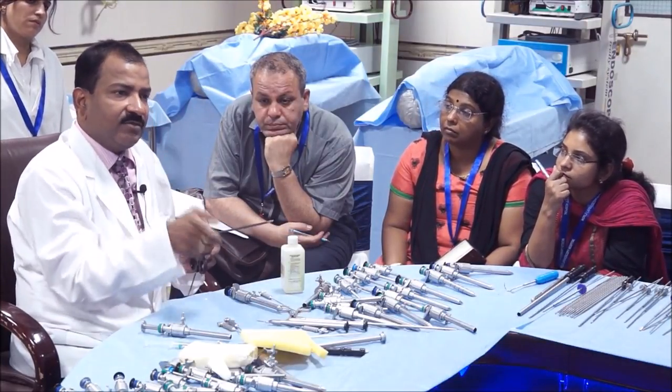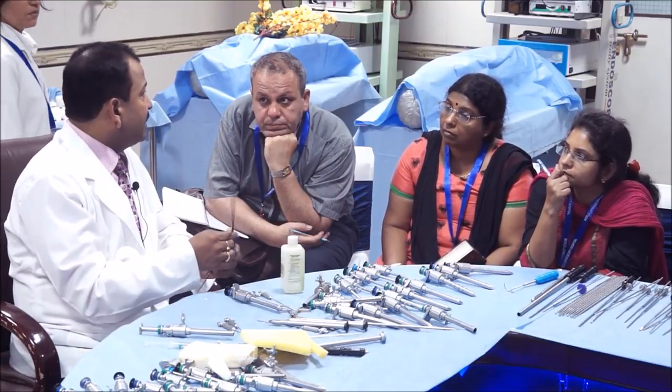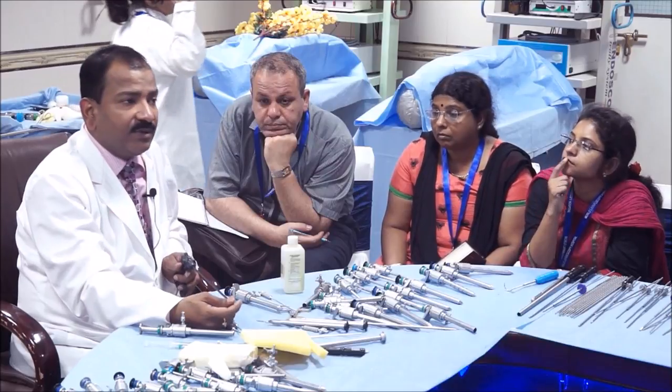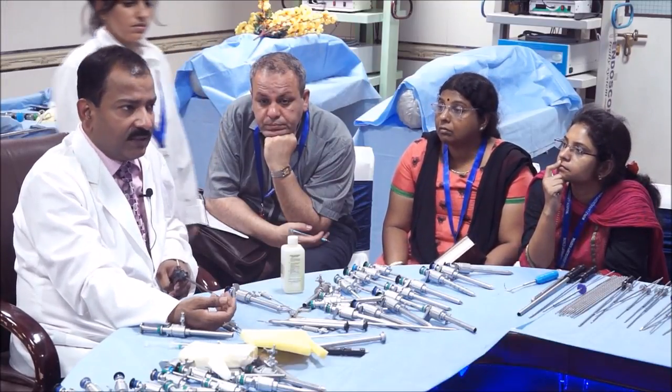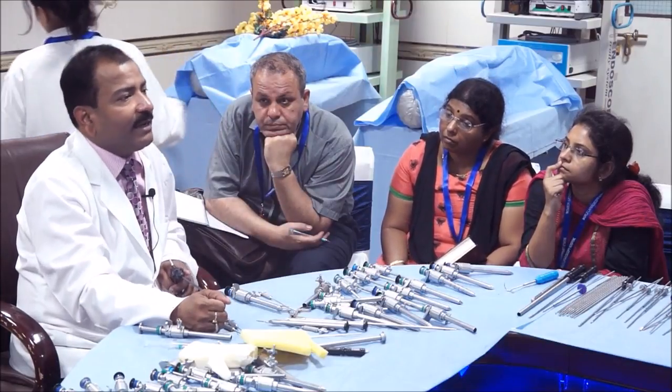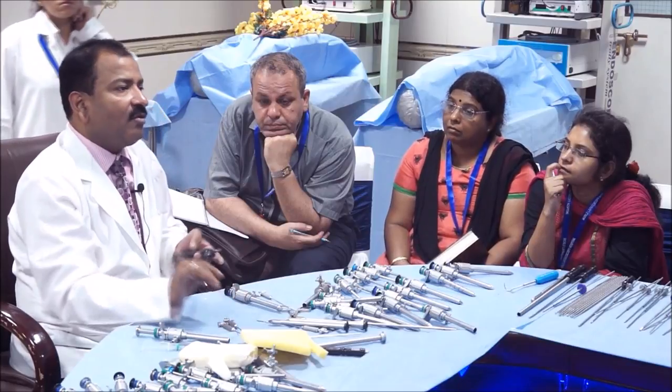Each and every instrument has to be wrapped with a separate polythene pack. It's a polythene wrap over the instruments. I will show you, and then you can autoclave. If you autoclave, it is sterilized. But if you are thinking that using only chemical sterilization means it is guaranteed, it is not. Do you know why?